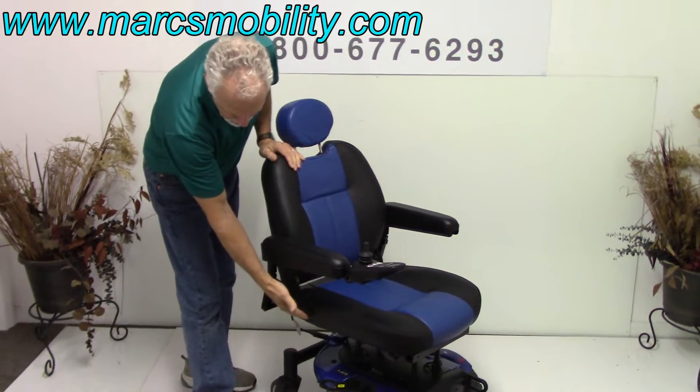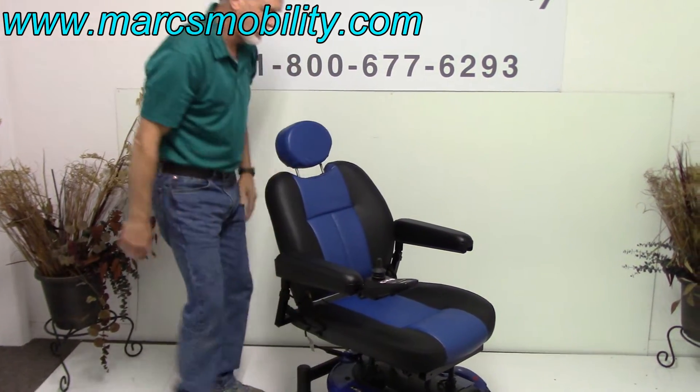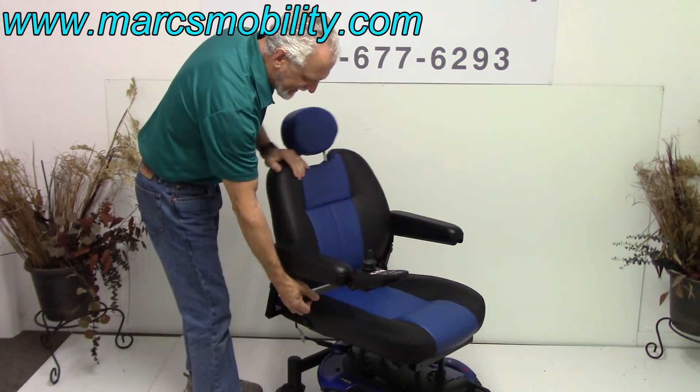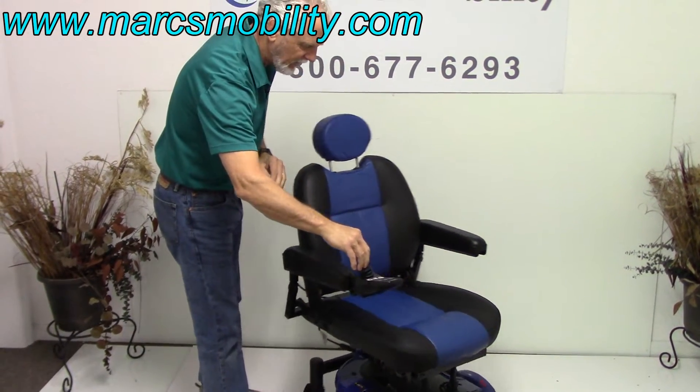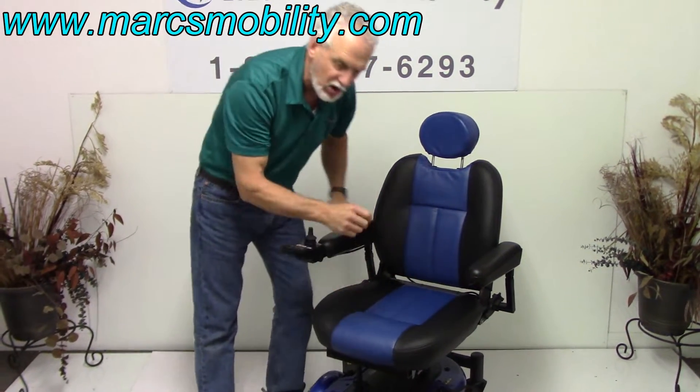The back is also adjustable with a handle here — I can move it all the way up. It's an adjustable back. So this is a captain seat, and the seat is 20 by 20, so it's a large seat.